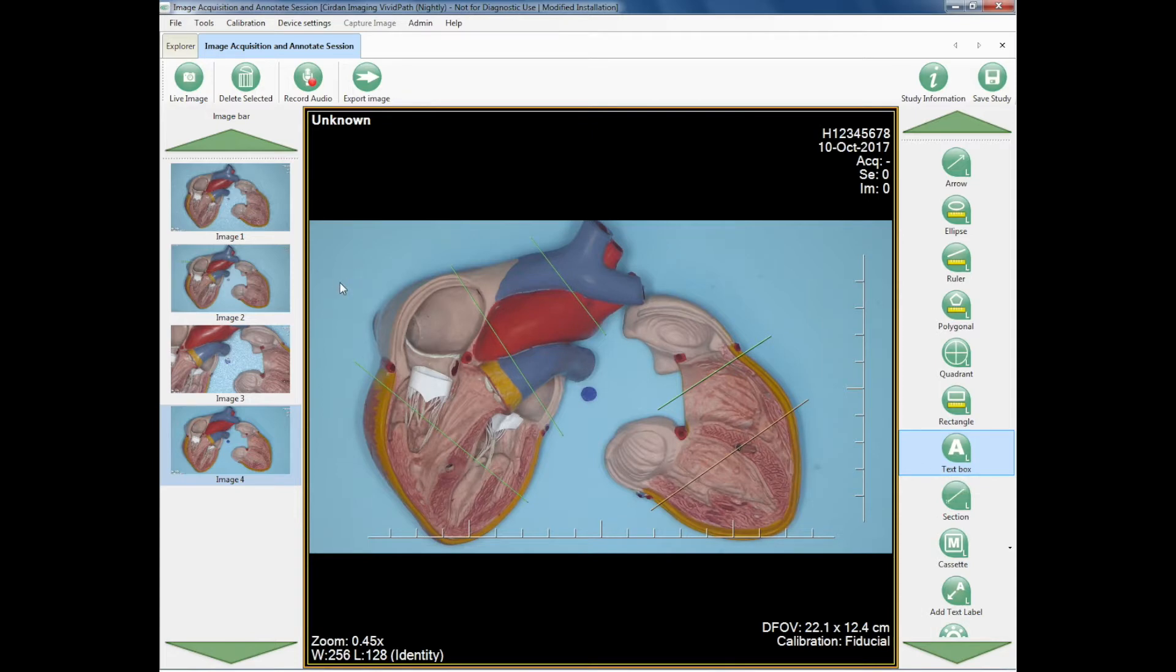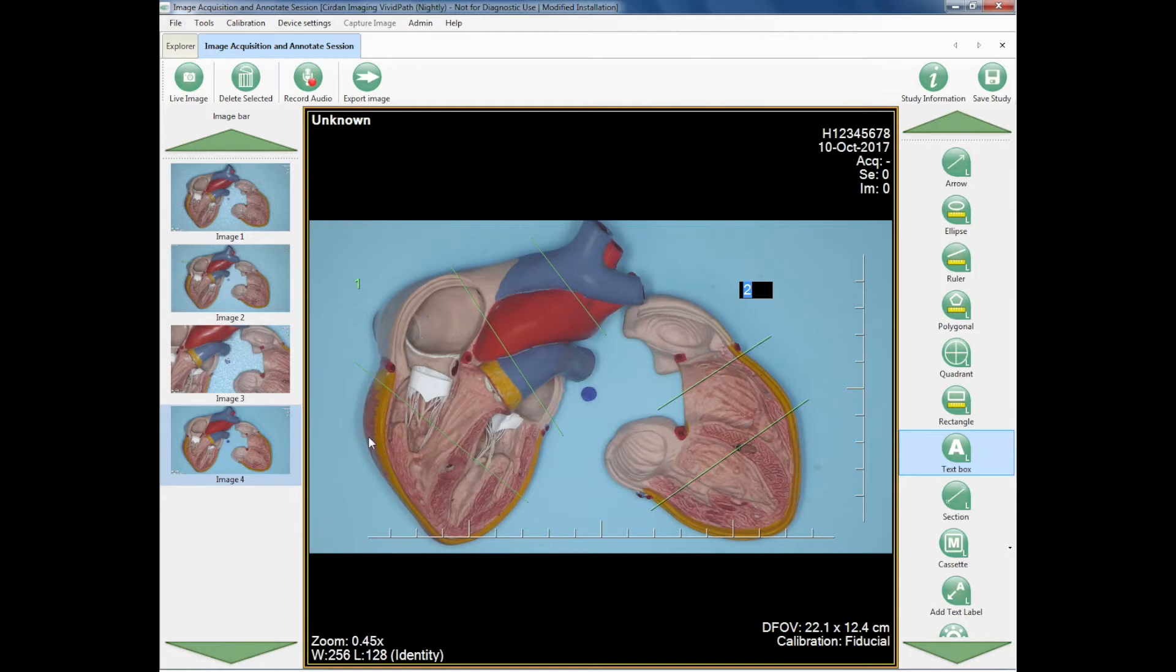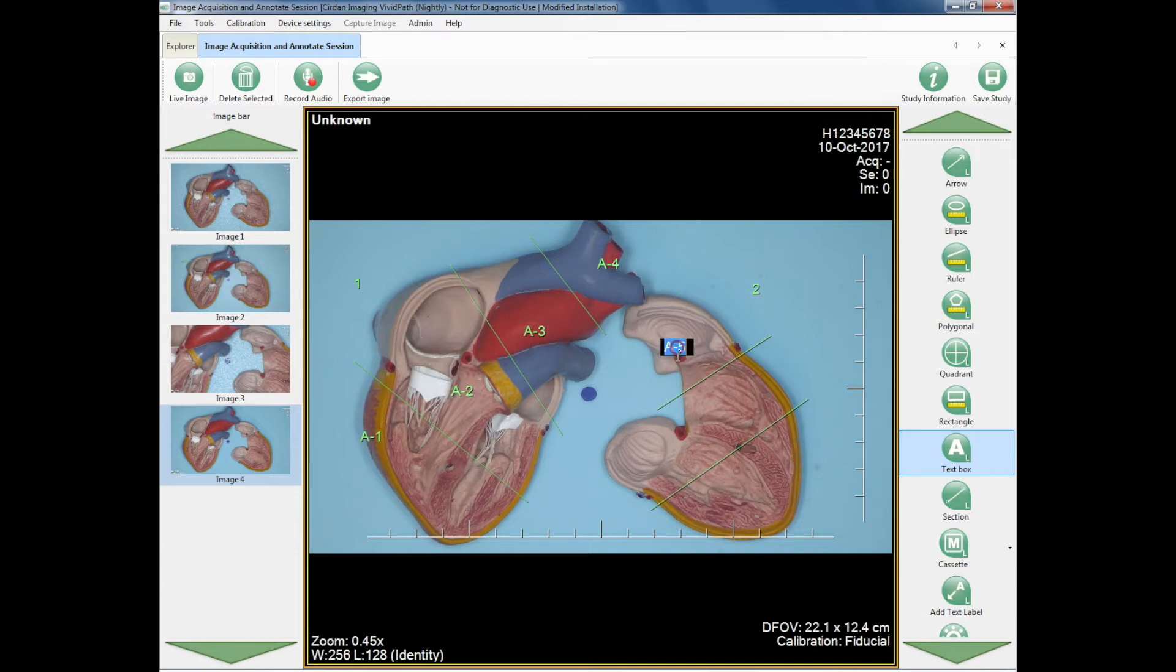The label tool, whatever the default starting position is, for example, if I start with one, then it will go to two, three, four, etc. If I start with A1, then A2, A3, A4, etc.